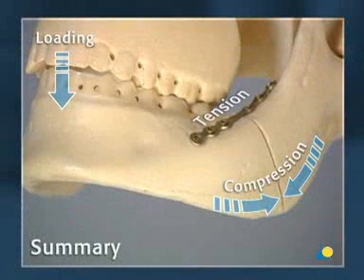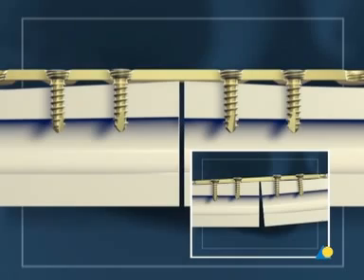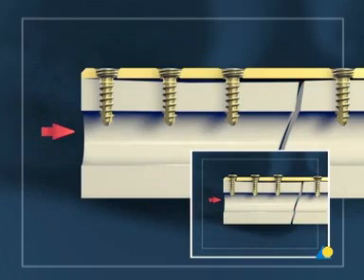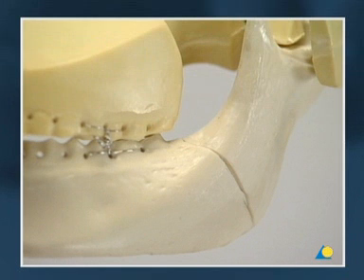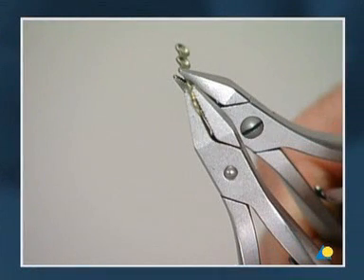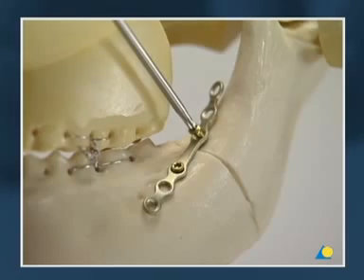This exercise has highlighted the principles of load sharing between the fixation system and the fracture surfaces in a simple transverse fracture, as described by Champy. In addition, the concept and advantages of a locking plate to help prevent primary and secondary loss of reduction have been shown. The main steps are: reduction of the fracture and MMF with Ernst ligatures, adaptation of the 6-hole 2.0 mandible locking plate, and fixation of the plate to the oblique ridge.